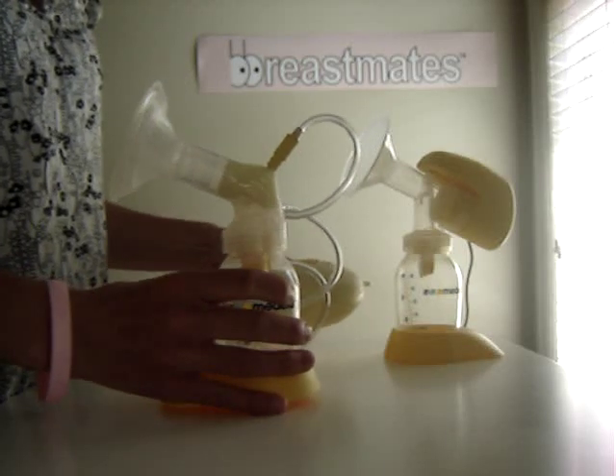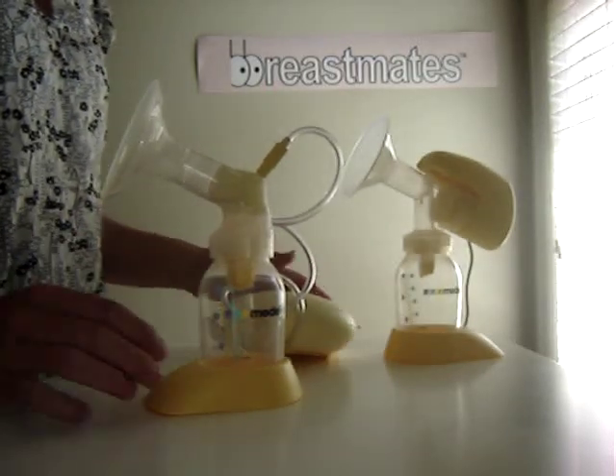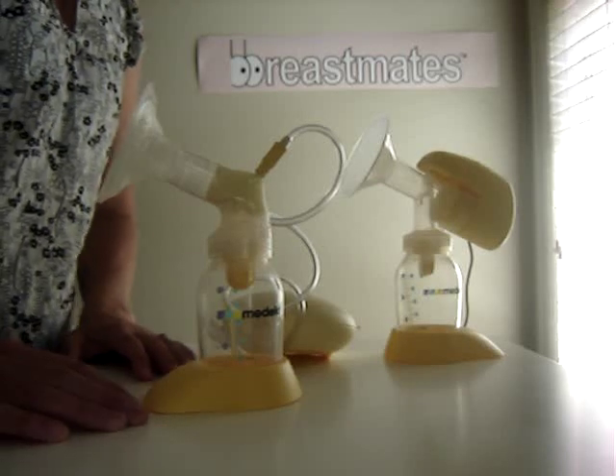It's a much quieter noise. It's a more premium pump. More information about these breast pumps on our website, breastmates.co.nz.